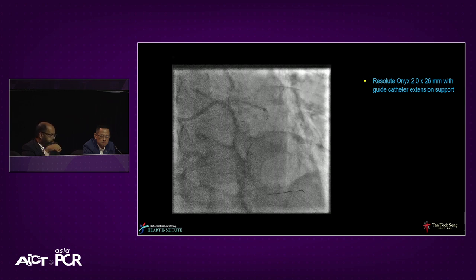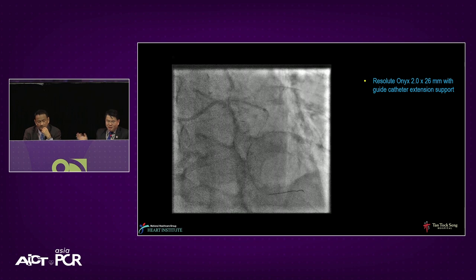Yeah, so let's say no imaging again. Is there any evidence to favor a stenting approach for heavily calcified lesions over DCB? Yeah. I think there's two issues here. Number one is a proximal lesion, and I would still like to consider stenting for that. The issue is, I think, trying to get the DCB to cross into the distal vessel, so the distal lesion.